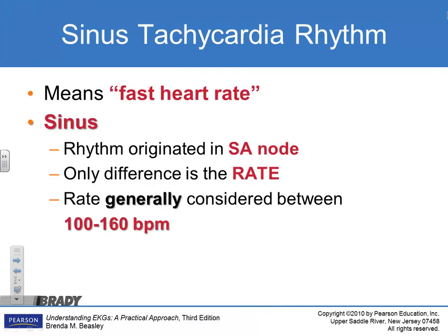All right, let's look at sinus tachycardia. Tachycardia means, this is where you say fast. Okay, there you go. Where does your sinus tach originate from? What node? SA node, because we call it what?